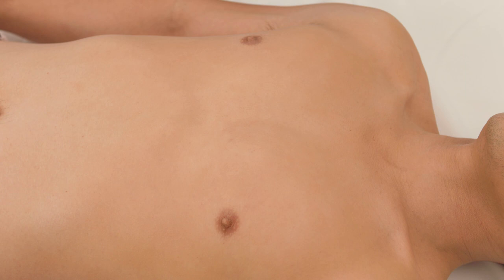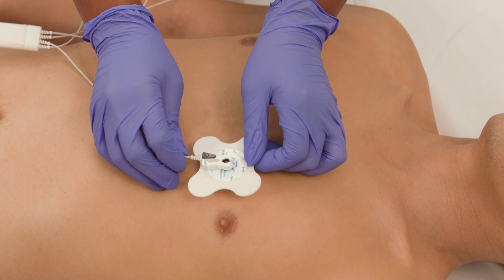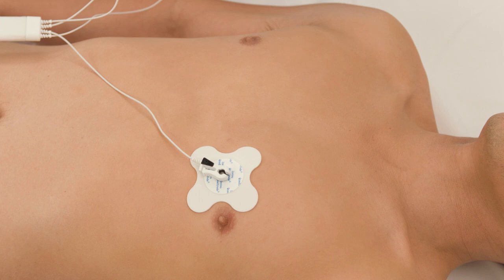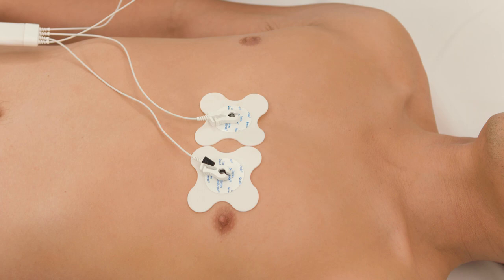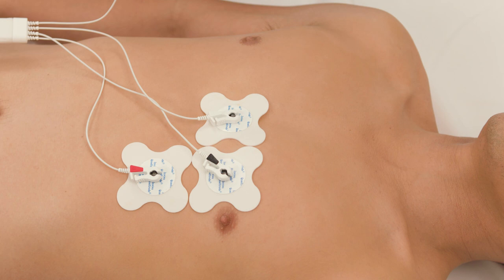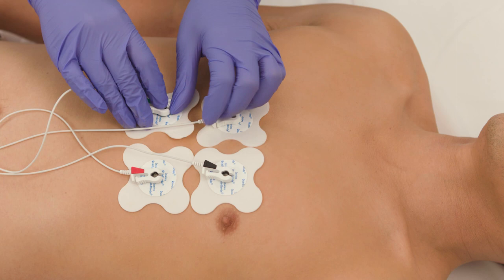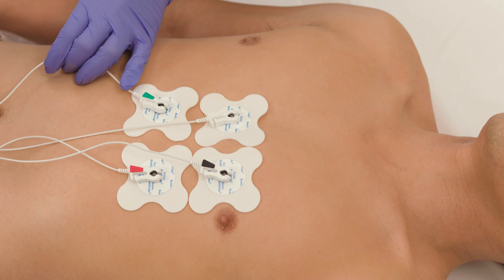When using the MR400 and the multiple patch ECG electrodes, you will go to the imaginary nipple line on the left side of the chest and place two in line between the left sternal border and the left nipple. Then place the other two below on the lower half. All of them will be on the left side. Do not center them on the chest. If the patient has a large breast, the lower electrodes go under the breast tissue, not on top of it.